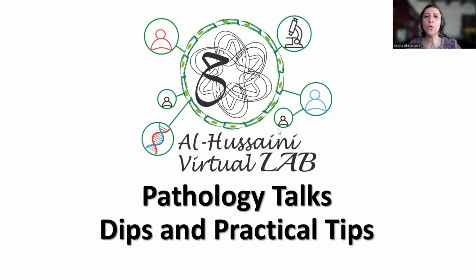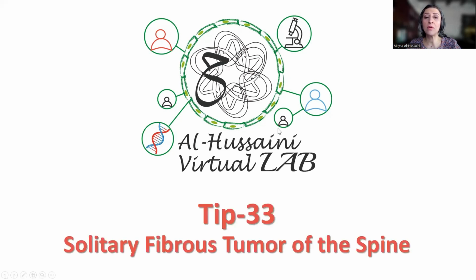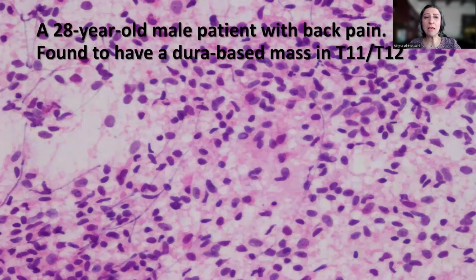Today, I'm going to share with you an interesting case of a solitary fibrous tumor arising in the spine, which is really a rare occurrence since solitary fibrous tumors, or what has been previously known as hemangiopericytoma, usually arise supratentorially. So this presentation is quite unusual. This is a 28-year-old male patient who presented with back pain and was found to have a dura-based mass at T11, T12. And this is the squash prep of the tissue at the time of frozen section.